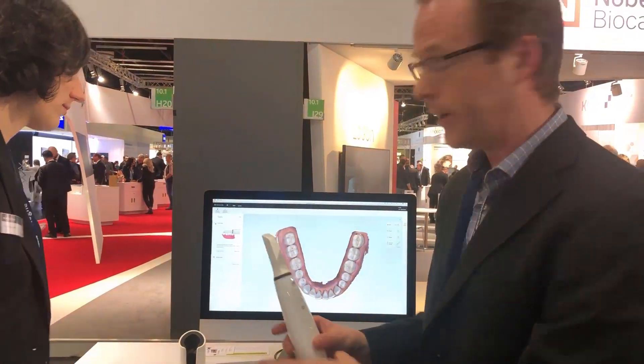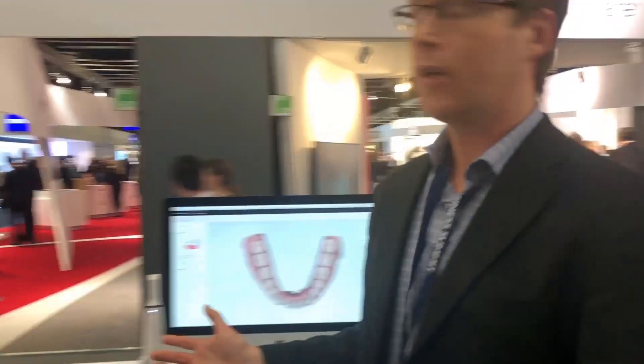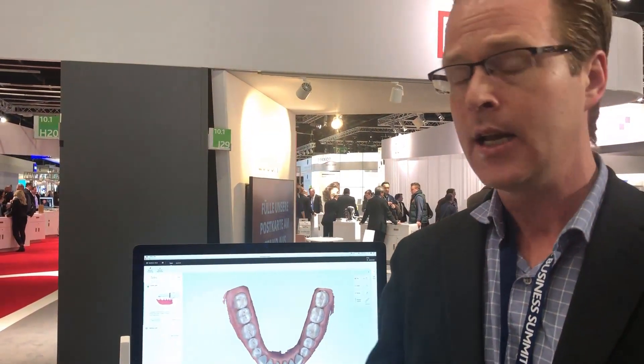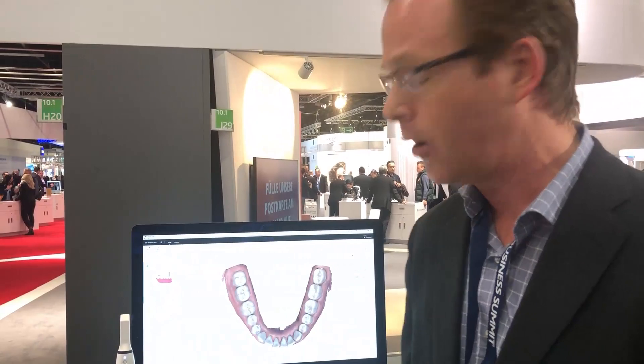Overall the scan looks pretty nice. It integrates with the DTX Studio side, which many Nobel users are used to working with for the CAVO cone beam scan and Nobel implants — it will plan CBCT imaging right away. So it's a very interesting, very promising scanner from CAVO. I look forward to seeing it here in the United States. This has been a review of the CAVO X-Pro.